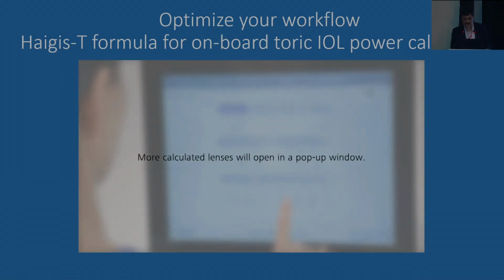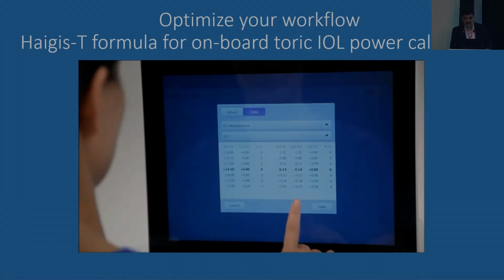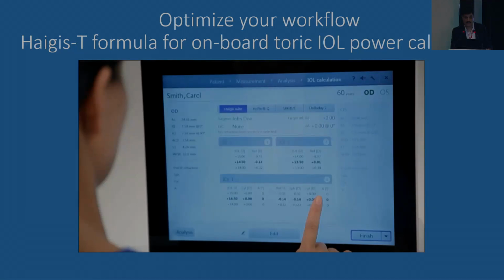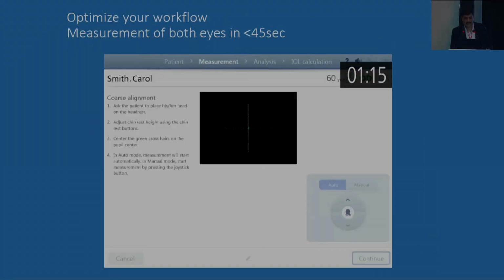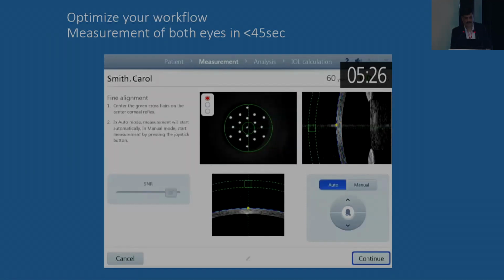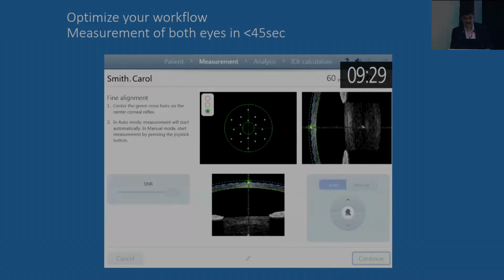Now what we normally do: the patient comes, we do the biometry, then we send for counseling. Because if they have astigmatism, then you counsel them for multifocal or trifocal. Counseling without toric multifocal or toric trifocal does not make any sense. Normally, if you see how fast it takes the reading, the measurement from both eyes is less than 45 seconds. This is very, very important.